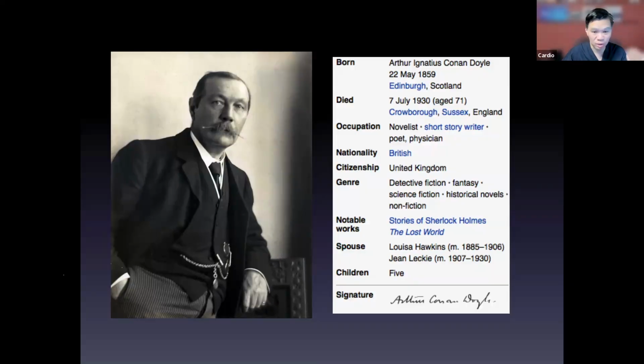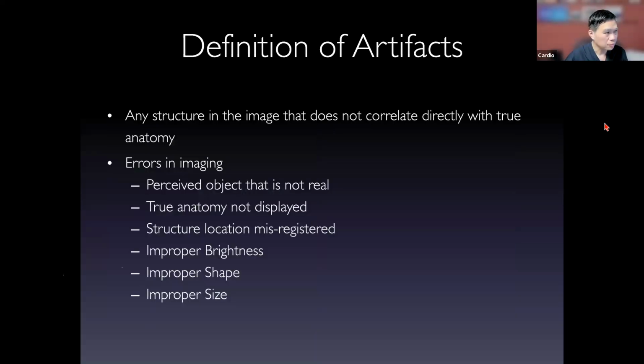So every day, when we are reading echoes or actually seeing patients, we apply our power of observation. I think, as a technology guy, I still very much pride myself on the fact that as physicians, we actually use our power of observation to help our patients. There are certain things, even with multimodal artificial intelligence, that it may be quite some time before these are acquired by the technology. So let's move on.